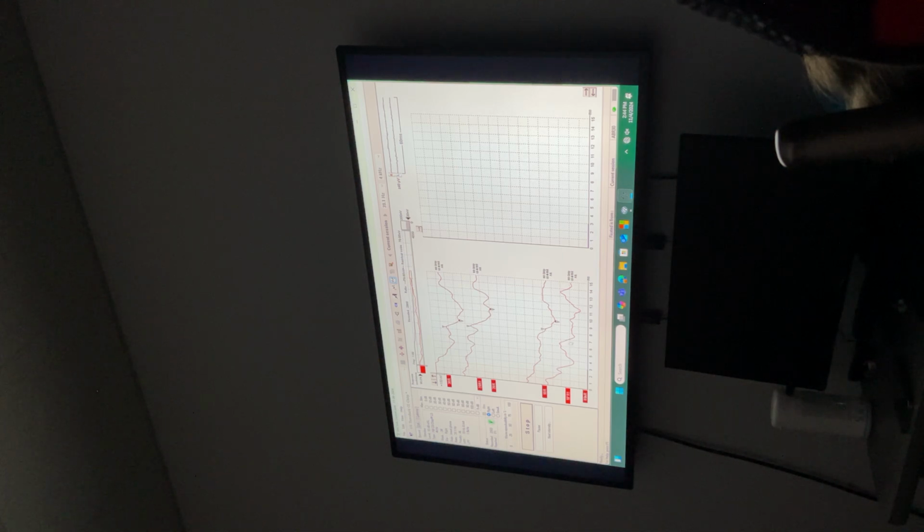So what do you want to do for 10 dB? There's something there. With this, there's nothing there. Okay. 20 dB definitely there's a response. You can do another recording. If there's nothing, or just take 20 dB as a threshold.